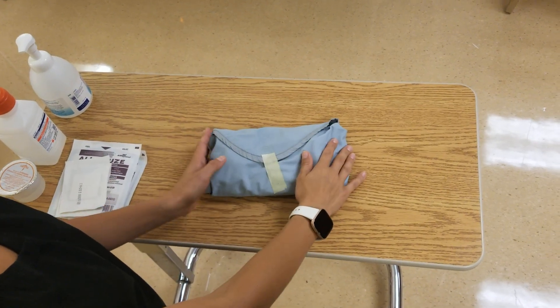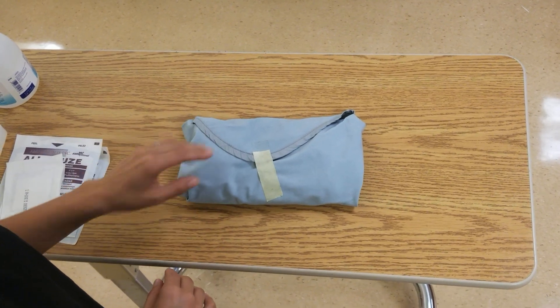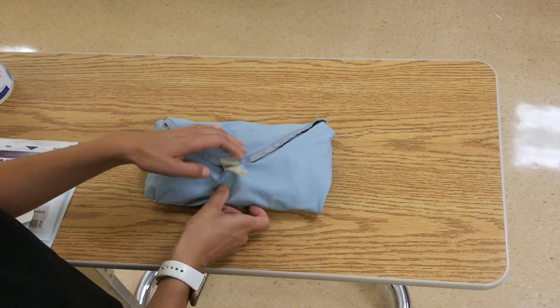We're just going to go over the difference of the reusable kit. Some sites such as HSC use this kit, so just to go over the similarities and differences between this and your student disposable kit.